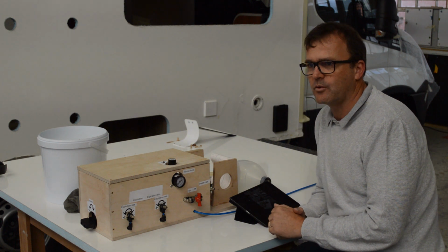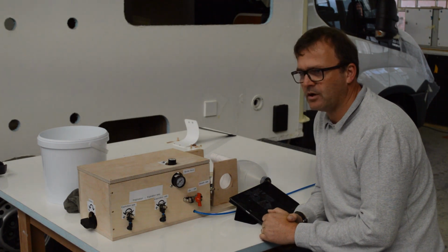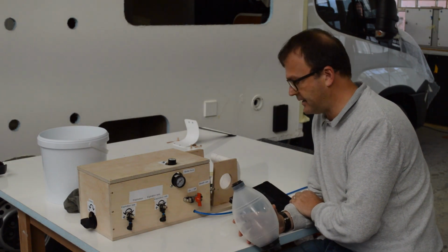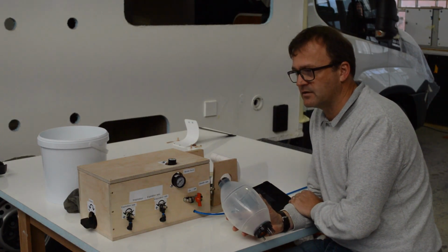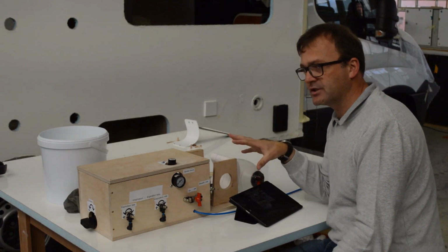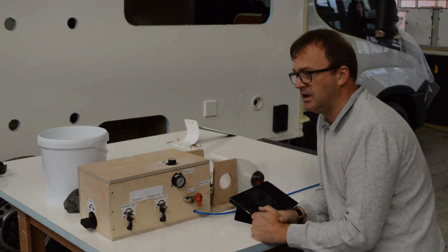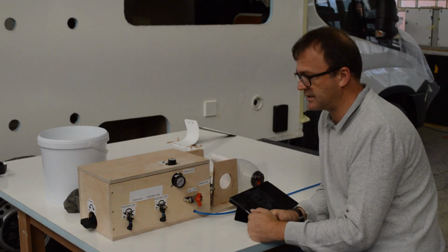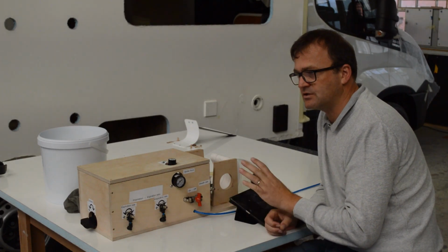My name is Dennis. I'm from Motorhome-World, and today we would like to do a brief demo of an automated BVM. I want to be very clear that we are not trying to create an ICU ventilator, but the idea of this is that it only works with air pressure. So we've got our air pressure plugged in from a compressor. It's our factory air, so it's not clean air or anything like that. The air is used just to drive the system. It doesn't go to the patient.